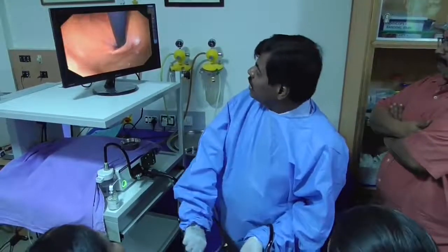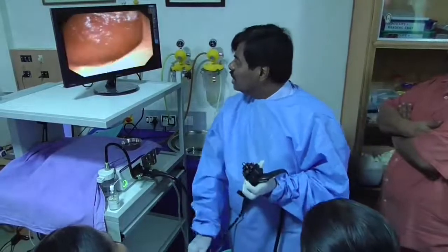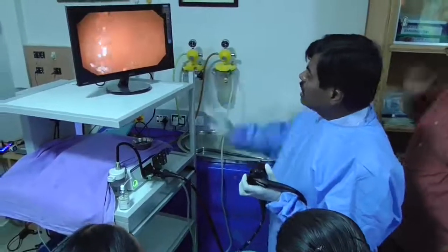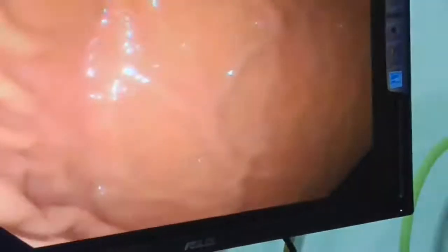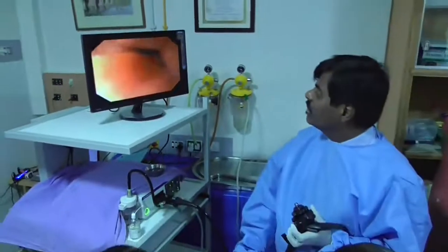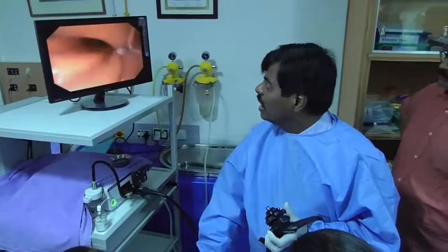As you can see, the scope is nicely gripped at the hiatus — no hiatus hernia or laxity, so the hiatus is quite competent in this case. The last step before withdrawal is the distensibility test: look at the screen — there are hardly any rugae. I suck, and as I suck the rugae form nicely. Then I insufflate again and the stomach distends as fast as it did before. This test is performed to exclude linitis plastica. Then suck out all fluid, keeping an eye on the patient's comfort.